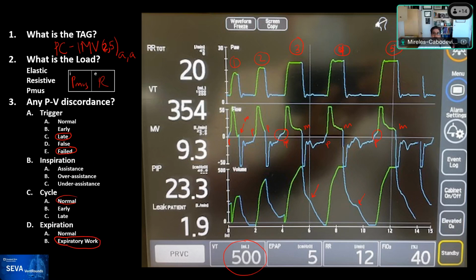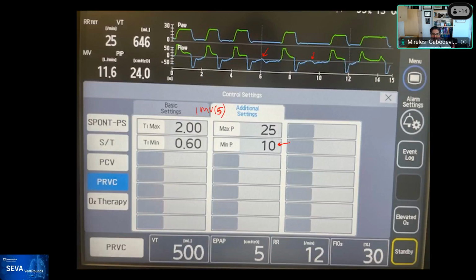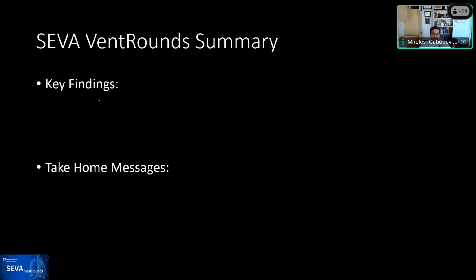All righty. Actually, this patient was having some major issues with the ventilator, so we adjusted, and he got better with it. So the key findings, the first one is just remember the taxonomy can help you immensely, and sometimes you don't have the time to go over the careful analysis of this. So just remember the Vent Mode app has this, for every single one of these ventilators. This one is under portable, although we have discussed how we're going to move them, but it gives non-invasive and invasive.